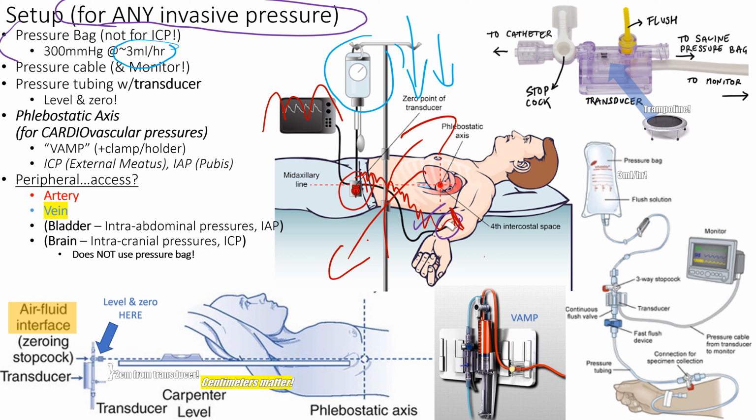And then when you have a PA catheter, you are infusing one bag and two bags, because you're infusing multiple lines. And now it's like 300 cc's per day. That makes a little more sense.